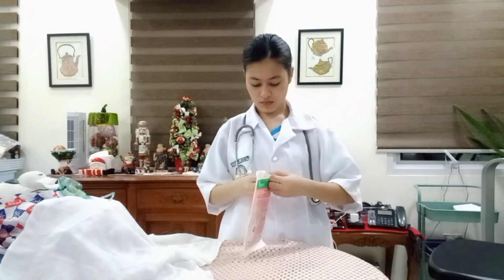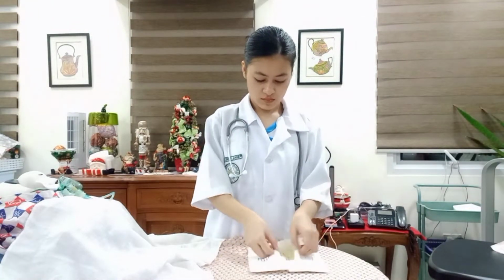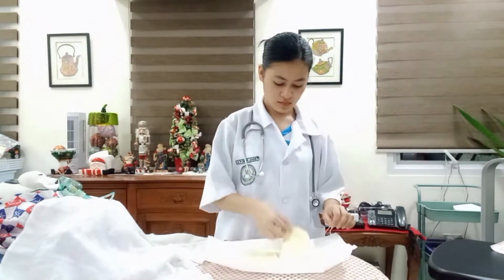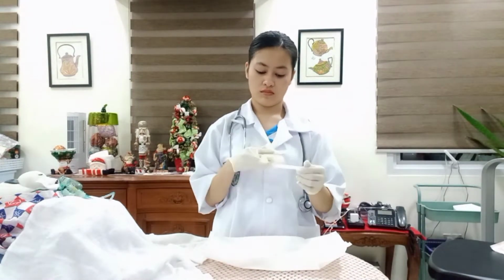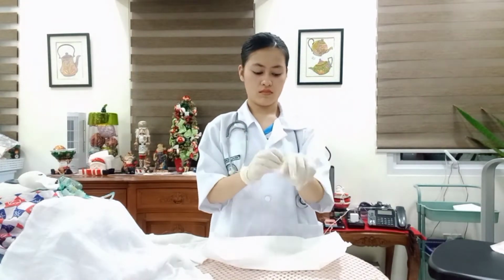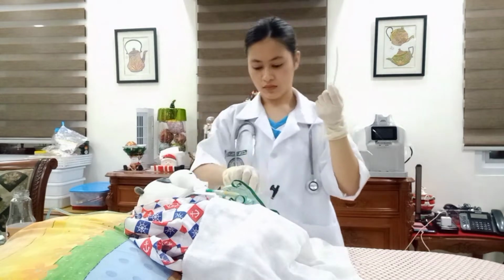Next one is don sterile gloves, suction the tracheostomy tube, remove and discard the soiled tracheostomy dressing in the appropriate receptacle, and then remove and discard your gloves. For the rationale, suctioning clears the tracheostomy of secretion that could occlude the outer cannula after the inner cannula is removed for care.